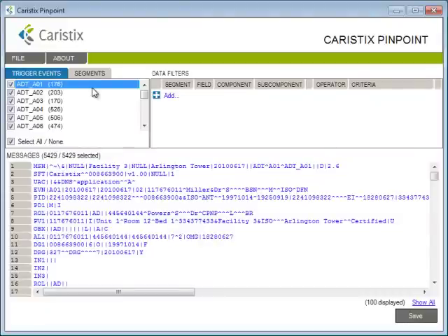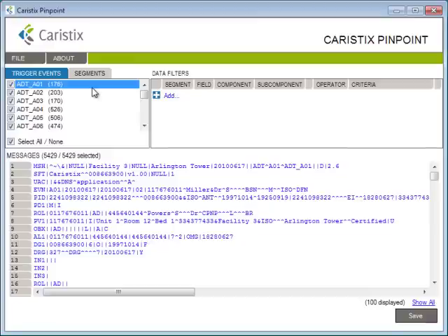And that's Pinpoint software in a nutshell. You can filter on trigger events or segments, or you can look for specific data. It's that simple. Download a Pinpoint trial today, and see how much easier it is to troubleshoot your interfaces.